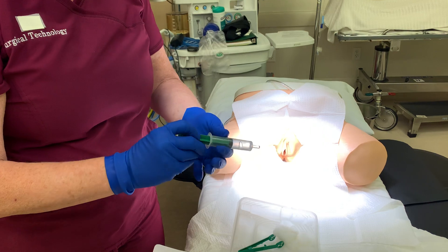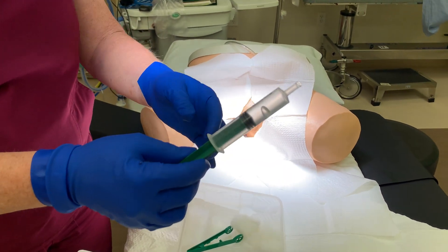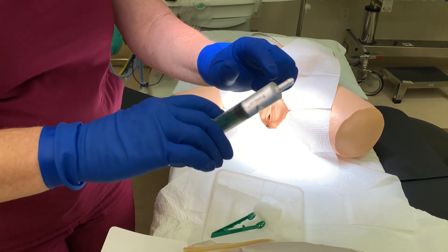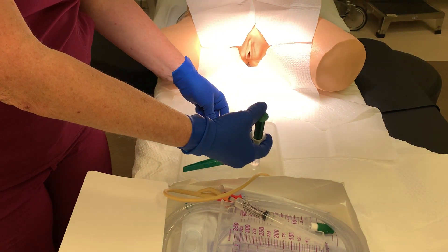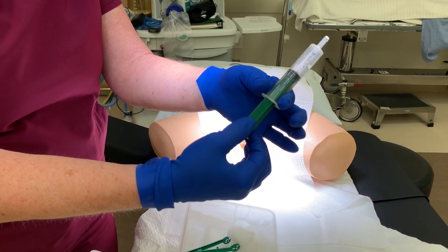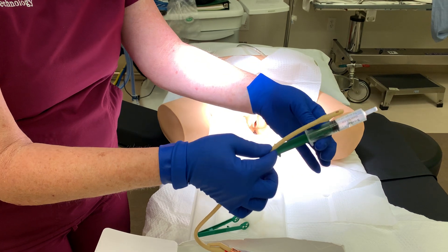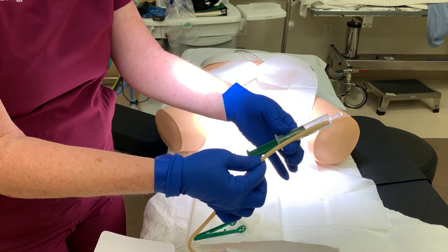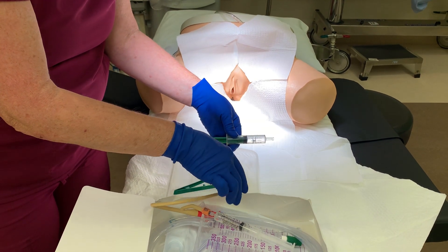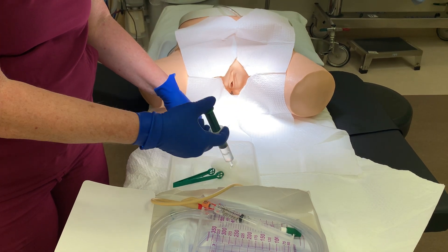This is the kit we used to show you the parts — that was the square kit. This is the rectangular kit. I want to talk about this lubricating gel. It's okay to dispense all of this into an area on your prep tray. But some people remove this green plunger — or whatever color it is — remove this plunger, leaving all of the gel in there, and simply stick the catheter in and advance it into the entire syringe and let it set there. So that is one option. You will see people do it a couple of different ways. We're going to go with dispensing it out into a place in the prep kit.